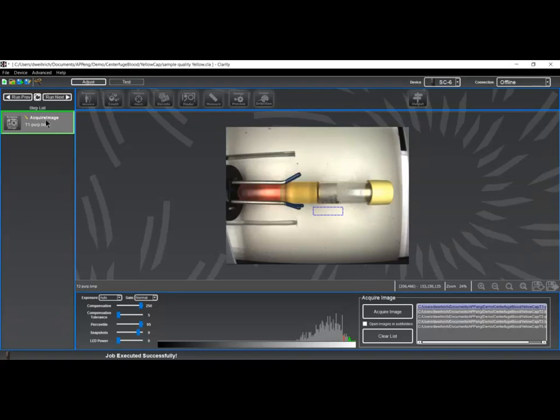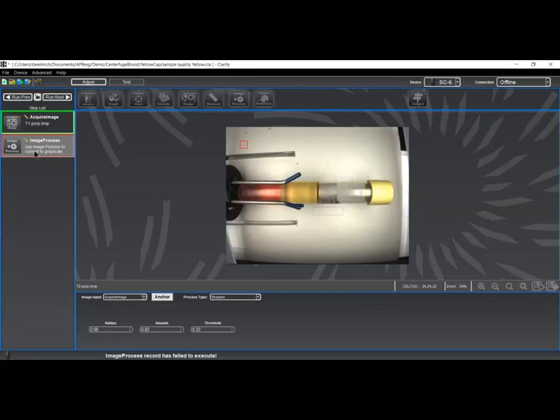We've already talked about the acquire image step. What I have to do next is to grab this feature of the cap and lock to it in order to position the rest of my processing. This will require a pattern match process. However, pattern match and a number of other processes do not operate on color. So I have to take this color picture that I have first, and I have to insert an image process step. Basically, all I'm doing with this step is converting to a grayscale image. Now I can add the pattern match step.